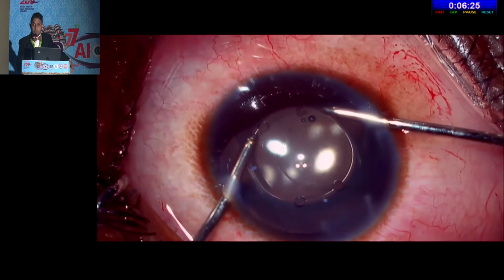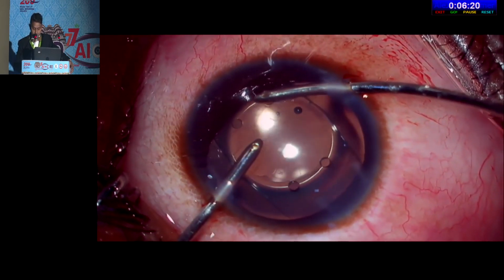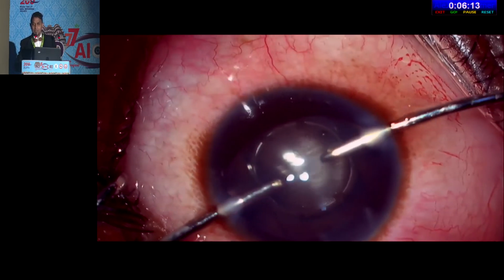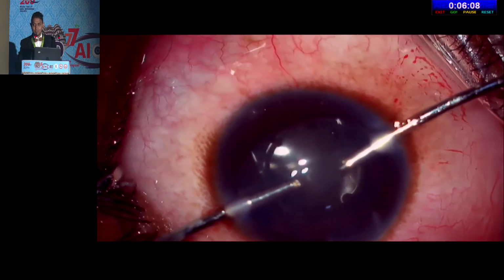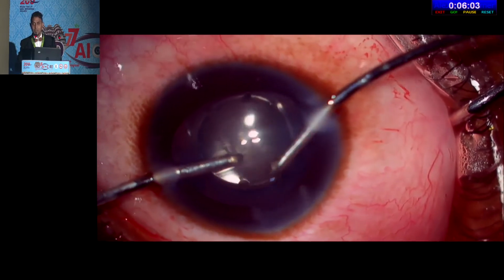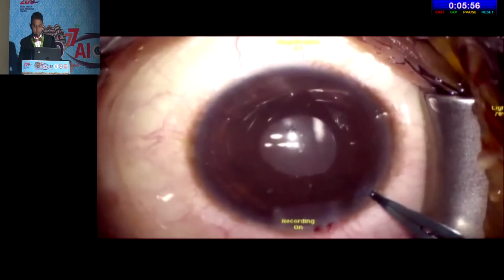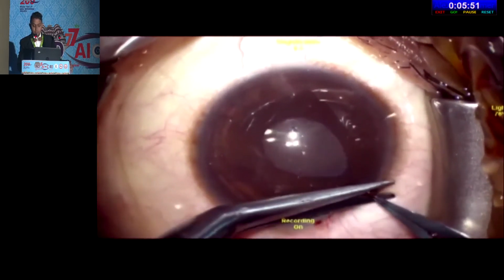The need for a surgical PI depends on the surgeon, because in a few of my patients I actually do a YAG PI one week prior to the surgery. It is much easier, the pigmentation is less, and once it starts bleeding while doing a surgical PI, you have a very tough time. You have to keep on washing, inject air, wait, tamponade the bleeding, and then wash again. So in some of my patients I do a preoperative PI with a YAG. Surgical PI or otherwise is depending upon the surgeon's wish.